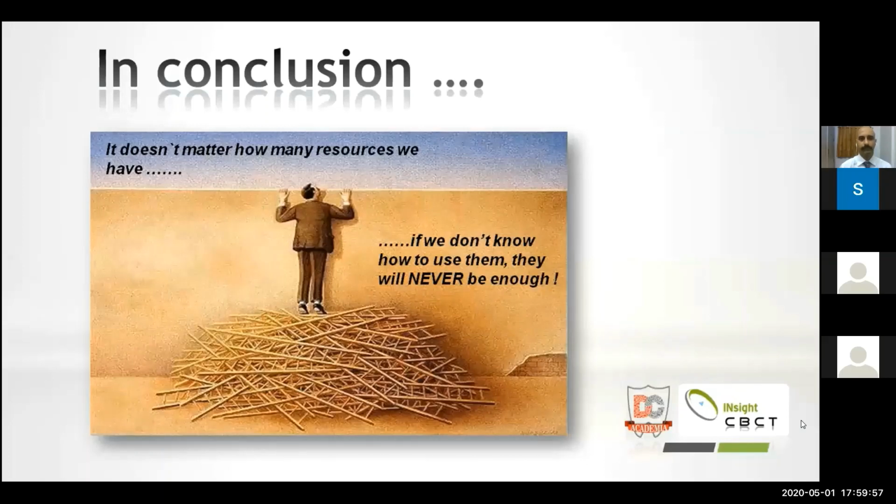That makes your workflow very, very stress-free, because whenever we go ahead with this kind of situation, we would like to have as little stress as possible and still give very fine results to the patients. This is what we are talking about: the placement of implants in the most ideal situation possible for the teeth. So it's the placement of the implant keeping the ideal position of the teeth in mind.